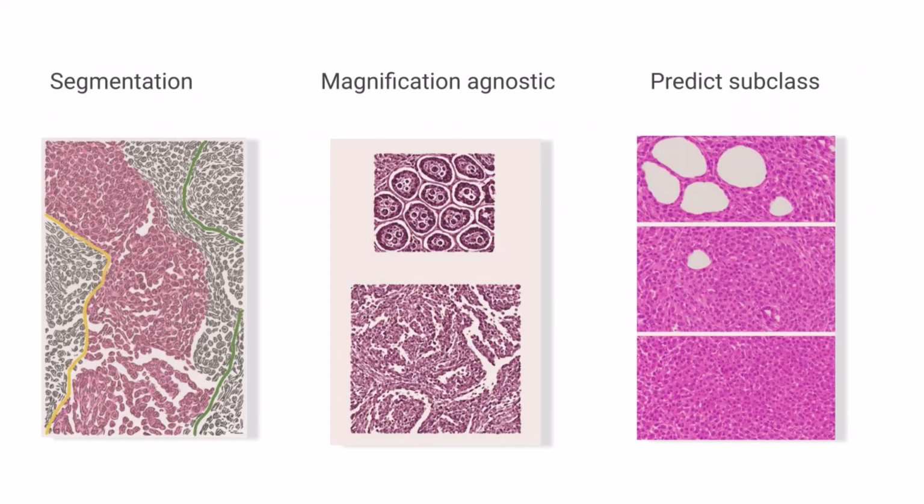Looking ahead, the LungHist700 dataset can be used for interesting applications. One direction would be to reframe it as a segmentation task, not just predicting the cancer type, but also identifying how far cancerous cells have spread across the sample tissue. Another potential direction is developing a magnification agnostic approach. The current baselines only use data from a single magnification level at a time. A magnification agnostic model could leverage more data for training, validation, and testing, and make it easier to combine LungHist700 with histological data from other datasets.